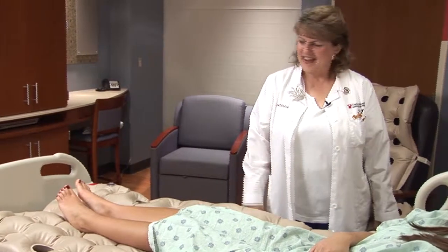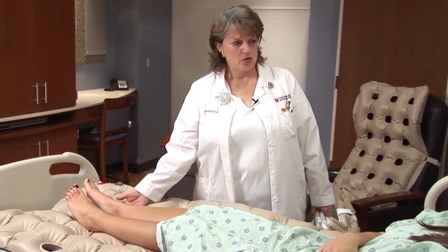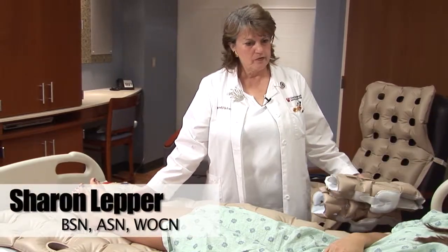Good morning. Hi. To further protect your skin and prevent any pressure sores forming on the bottom of your heels, we're going to put some waffle boots on you.